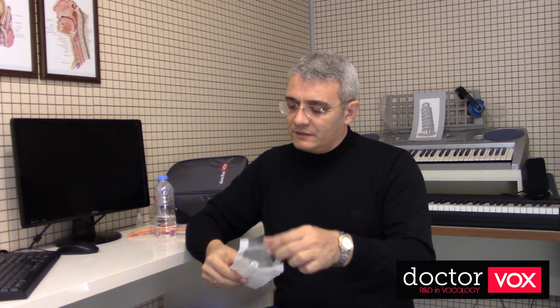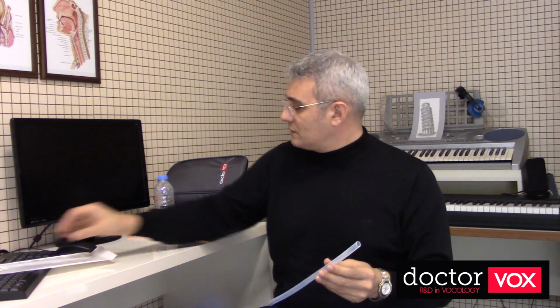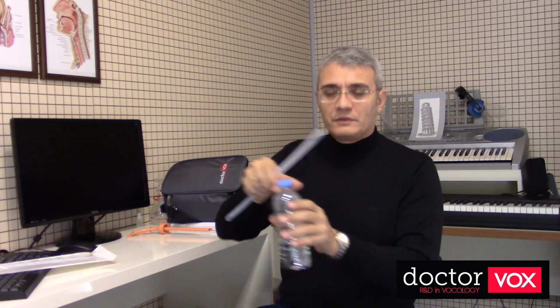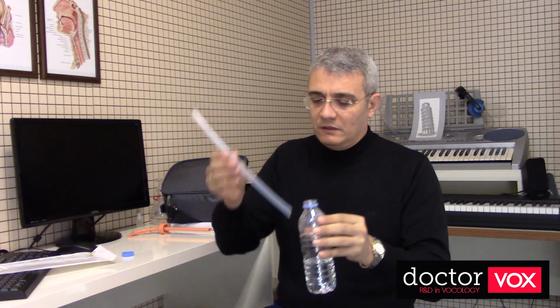I'd like to present you 3 different devices for application of Lax Vox voice therapy technique. The first one is the classical one. This is a silicone tube which was devised by Marketa Sihvo. After taking it out from its sterilized package, you can use the silicone tube, the Lax Vox tube, in a half-liter drinking water bottle, put it into it, and Lax Vox.